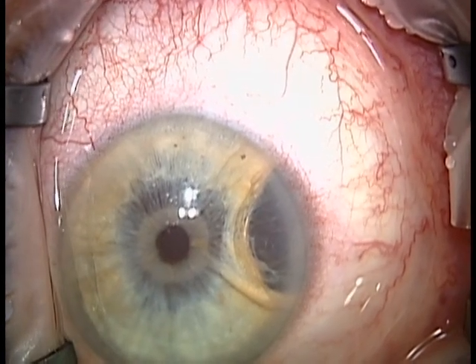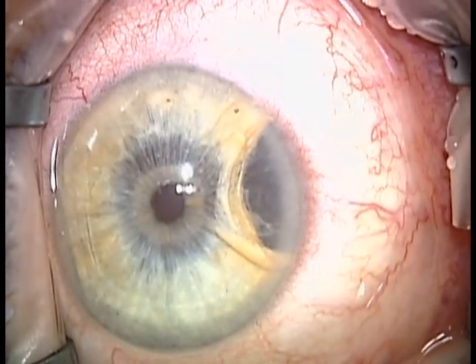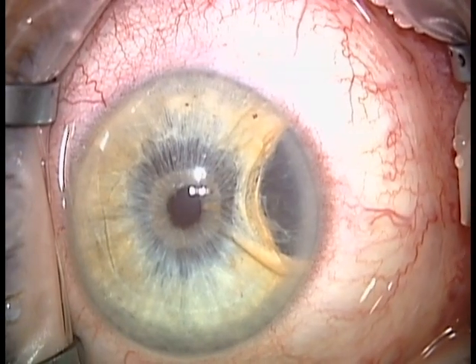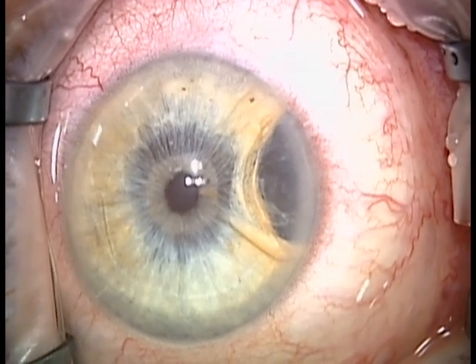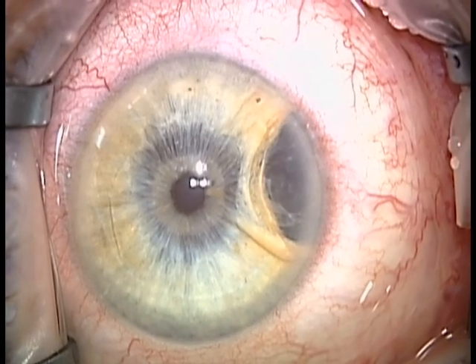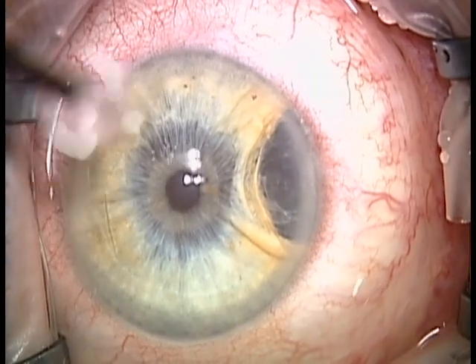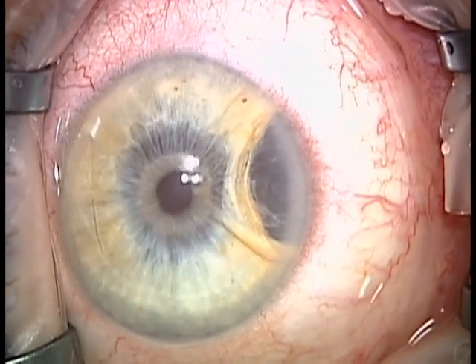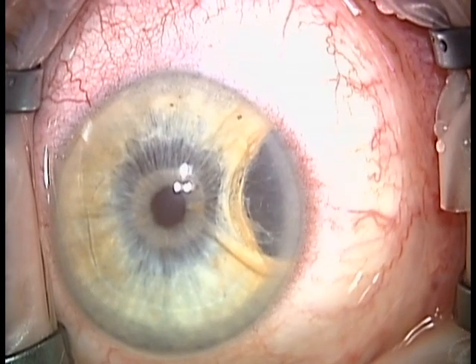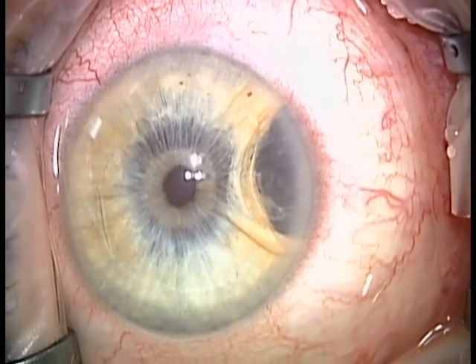This was actually first reported in 2003 in the Journal of Ophthalmology by Zora Baruzzi and coauthors. The injection technique was further modified by Carol Shields in a paper in JAMA Ophthalmology in 2014, and I will be modifying the injection apparatus again for this video. The goal is to drain the cyst as completely as possible, replace the contents with absolute alcohol, allow it to work, and drain it again.